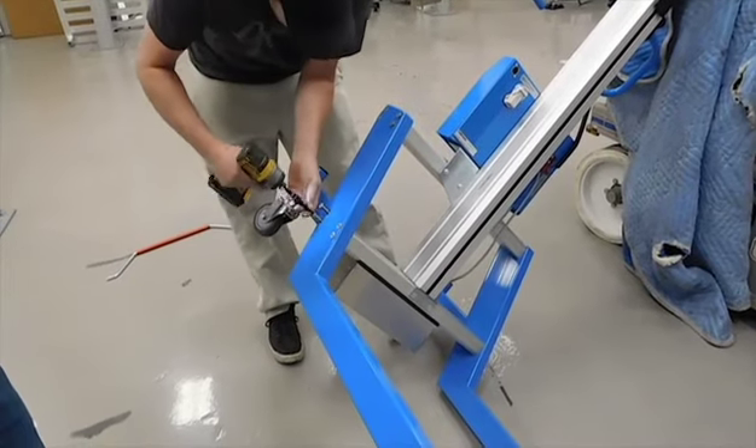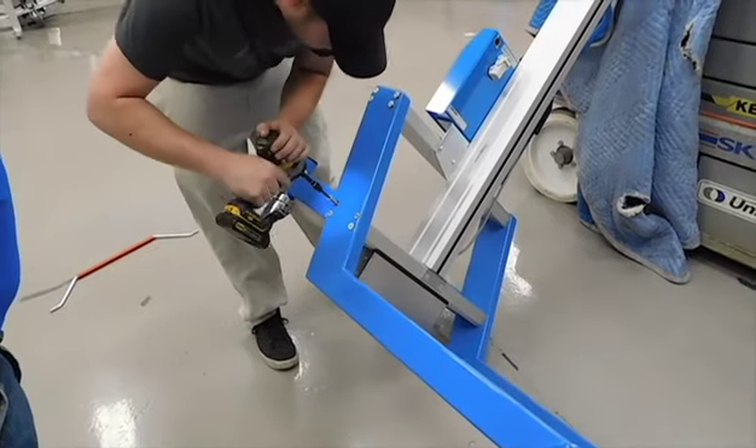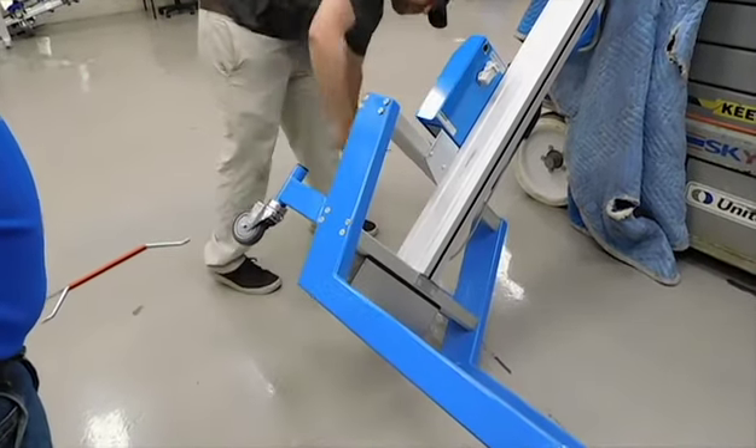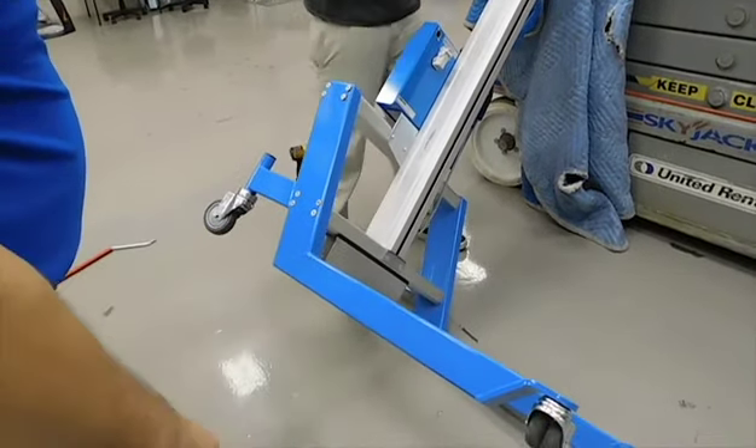Keep the bolt kind of loose, because after you put the other brake in — the other caster in — you're going to want to tighten all your bolts up so that both legs are level.